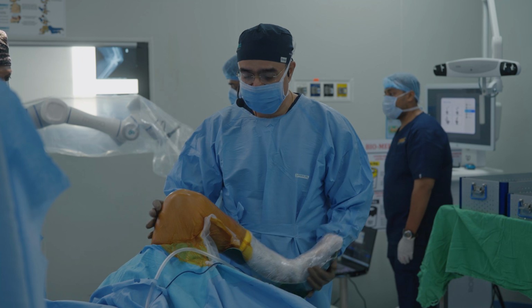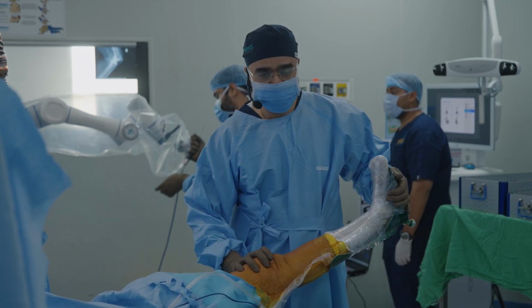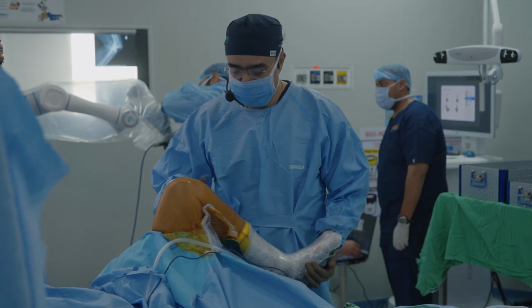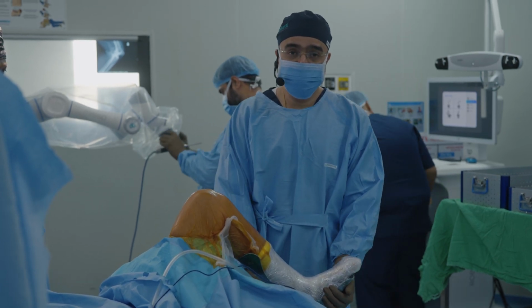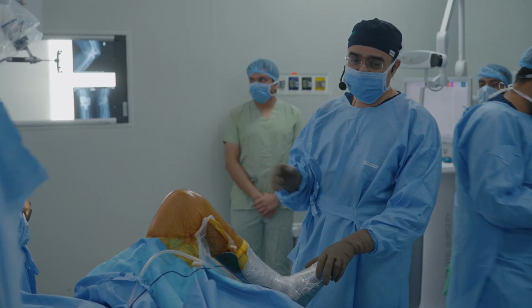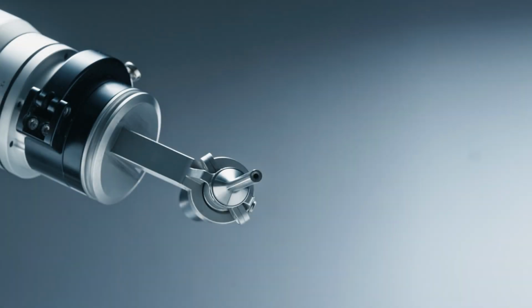So that's her max flexion and around 5 degrees of fixed flexion deformity, not much laxity in the knee joint, so pretty much a straightforward knee for total knee replacement. So this is a little robot dance you can see here. Now the calibration for this particular case is going on.